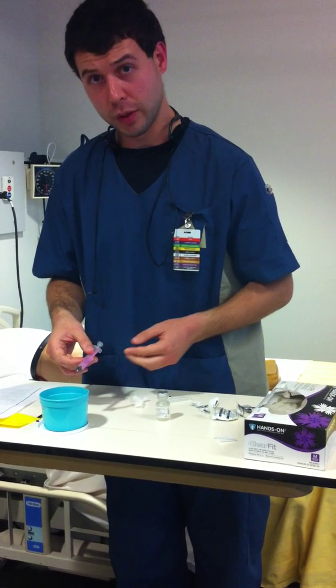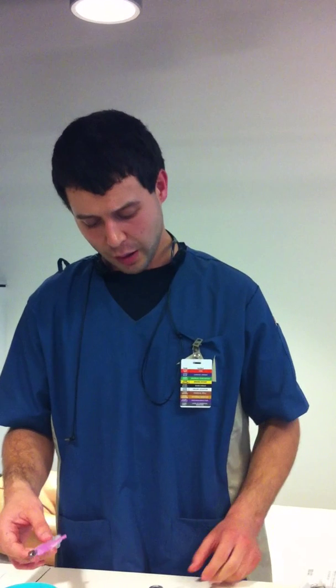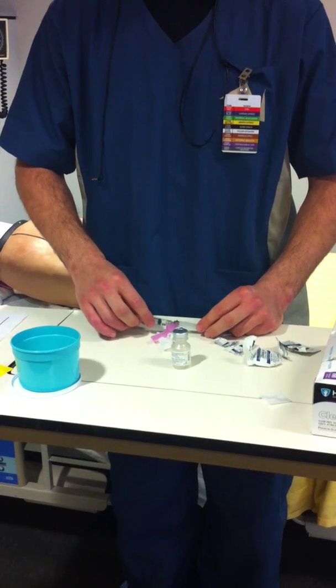Now after this, normally I would change the needle tip, because if I inject it right now, the needle tip is coated with medication and that could irritate the patient's skin. But because we are limited in terms of supplies for this demonstration, I'm going to use the same needle. So in this case, I'm going to put the safety cap on.